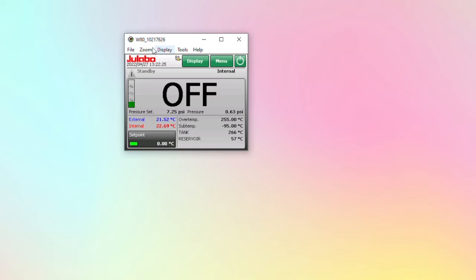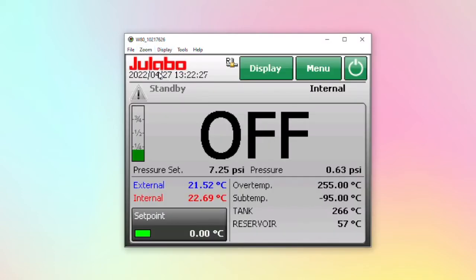It will connect to the device. We can make the screen bigger. And now you see on your computer screen exactly what is on the screen of the Presto.